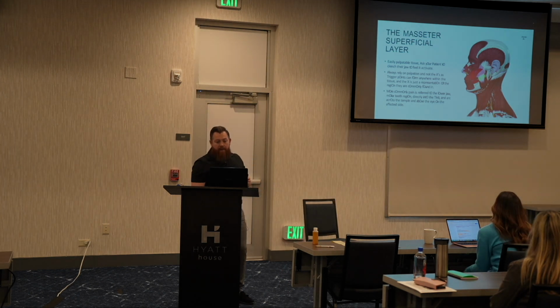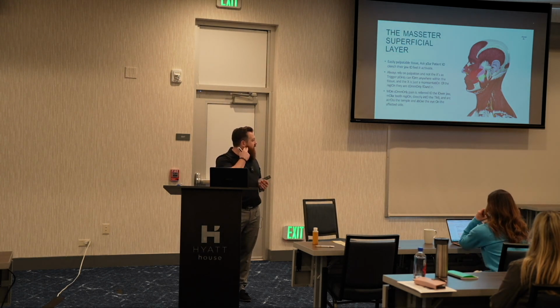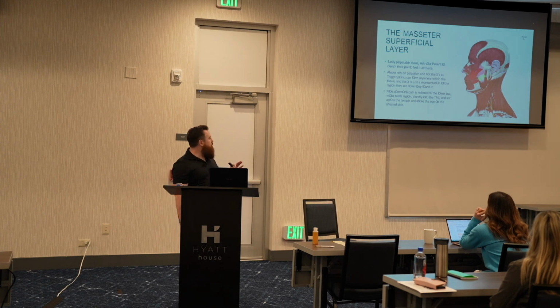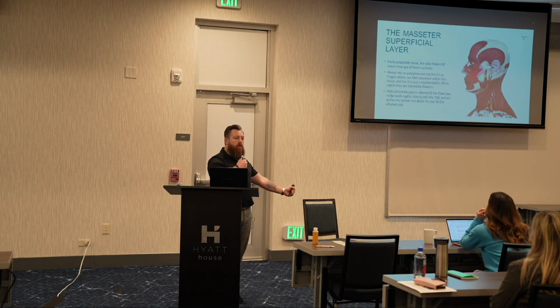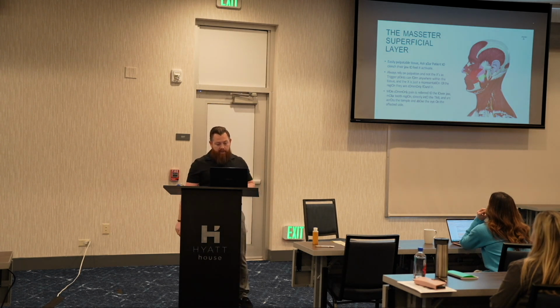So we'll palpate the tissue and we'll ask the patient to clench the jaw. So like we were doing earlier, we're going to get tissue activation just to confirm we're on the tissue. We'll palpate. Like we were saying, don't rely on the X's. So this isn't, I've seen the picture, I've seen the X's, we're going to hit the X's. Always palpate the patient, because otherwise we're still kind of like the guy with the bow and arrow. We're just aiming and hoping. Whereas when we palpate, we're much more direct.